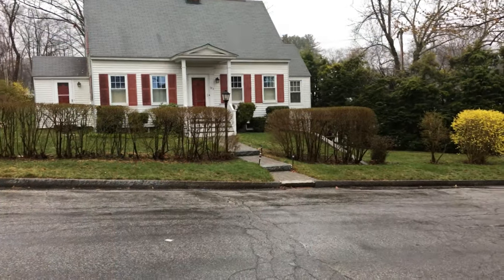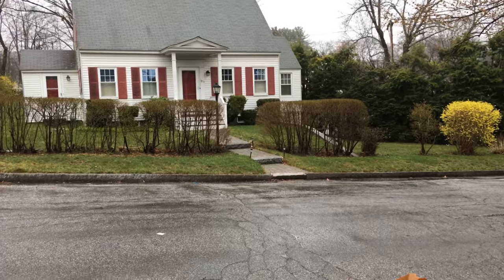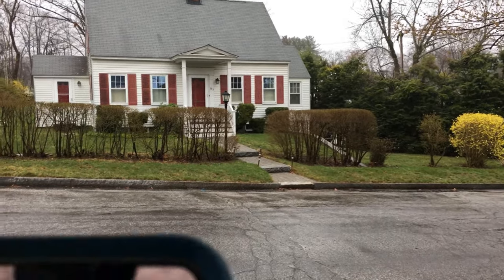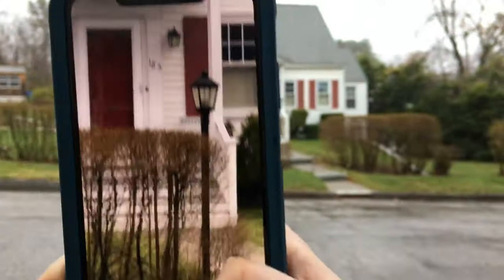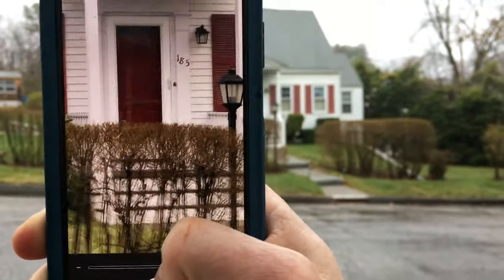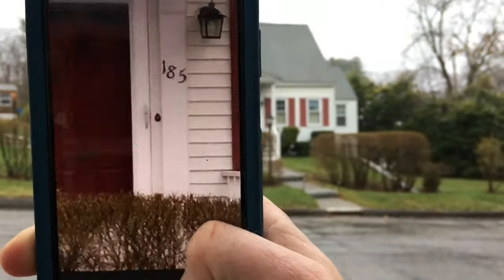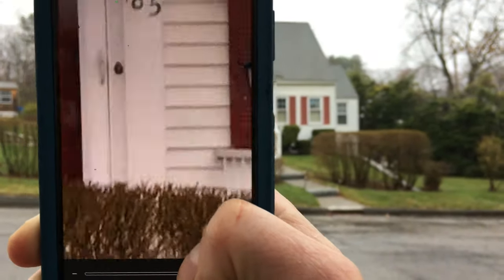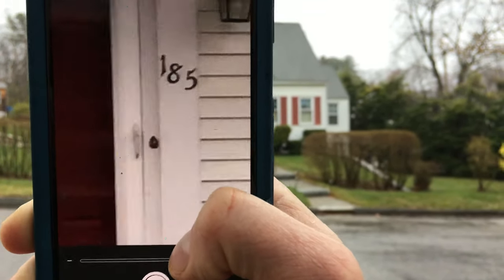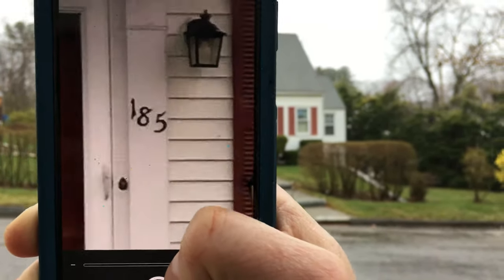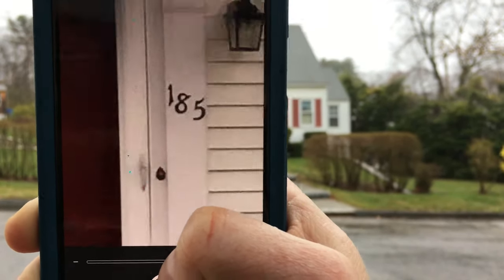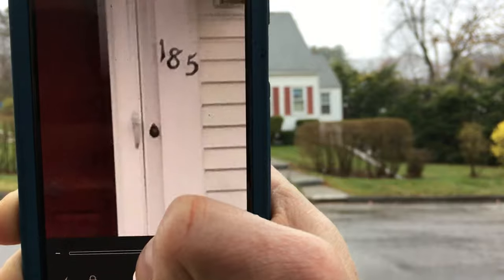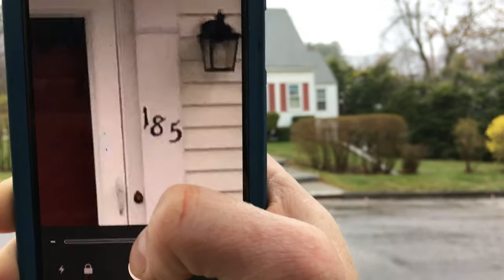Another practical example is using the magnifier to confirm you're at the right house by checking the house address. That house is across the street — it's a little far — but I'm able to zoom in and I can see the 185 address house number. So that's a good way to confirm that you're at the right address or house.